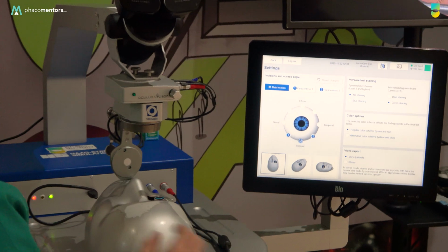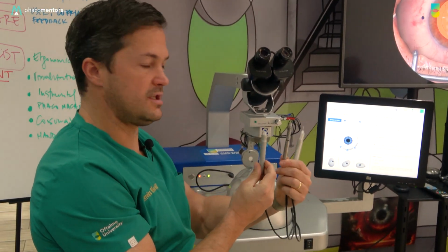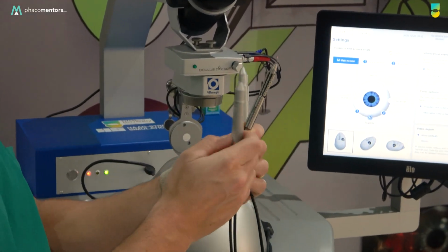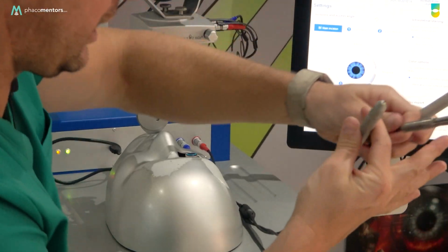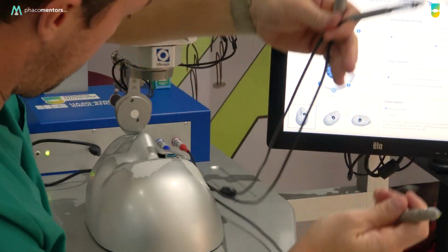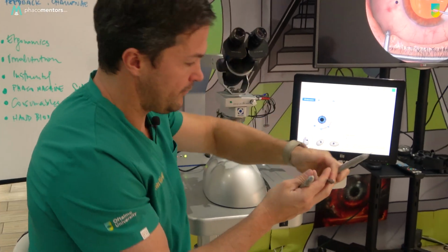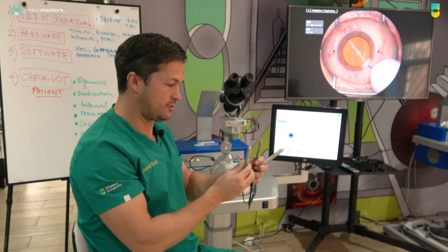And we really need to talk about this. You're going to have 3 instruments that you really need to take care of. They're very delicate, and it's important that you take care of them very well. And of course, always take care of the cables, like in this case, so they're not mixed. If you do a difficult movement, you can drop them on the floor, and that could be a big problem because, in order to work, they have sensors inside and rotational sensors.